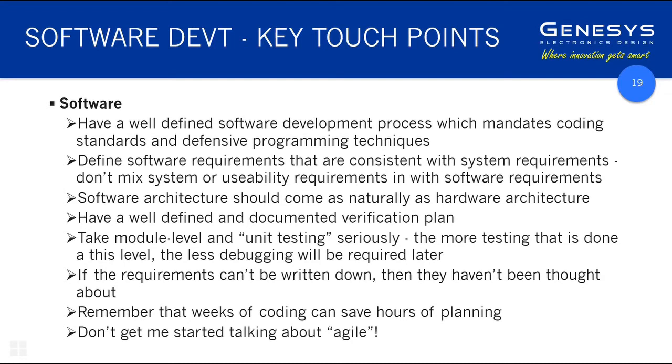Really cuts to the heart of this, minimum viable product. Would you just get out there, do a proof of concept, rip into the code, show that it works, and then worry about it all later. But for medical devices, starting off with bad practices is not going to get you to where you want to be. It's a little bit like designing a car by designing the steering wheel and the dashboard first. The application software is the steering wheel and the dashboard, and all the rest of the car is the under the hood stuff that you have to have right for the dashboard and the steering wheel to be of any use.